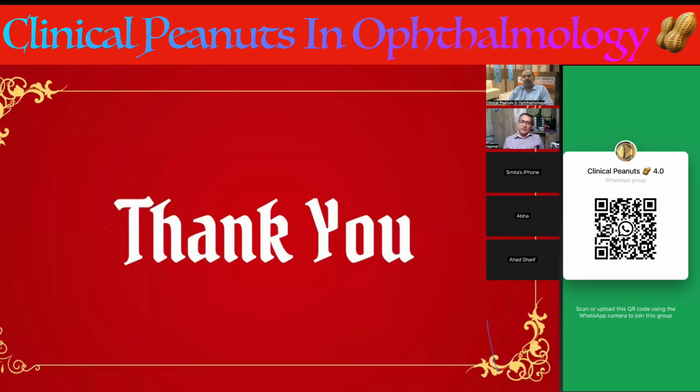See, if it is less than one, then I do not go for LRI. I just give an incision in that axis. That is enough. Practically no one is doing LRI for calculating, because that much prediction is not there. Regression is there and everything is there. It sounds very fascinating, LRI, but it doesn't work that way, actually. Okay, thank you so much.